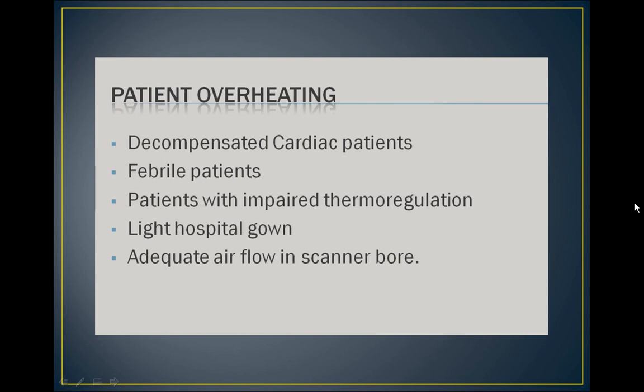Overheating is an issue with larger patients due to the use of more RF energy to create the MR image and the lack of airflow within the bore of the magnet. These patients should be monitored closely and brought out of the scanner to cool down if necessary.